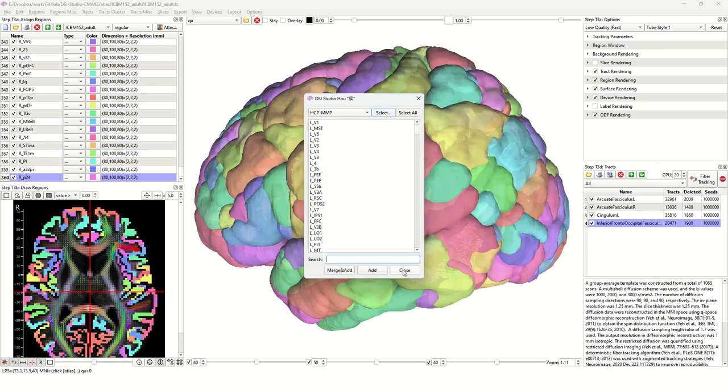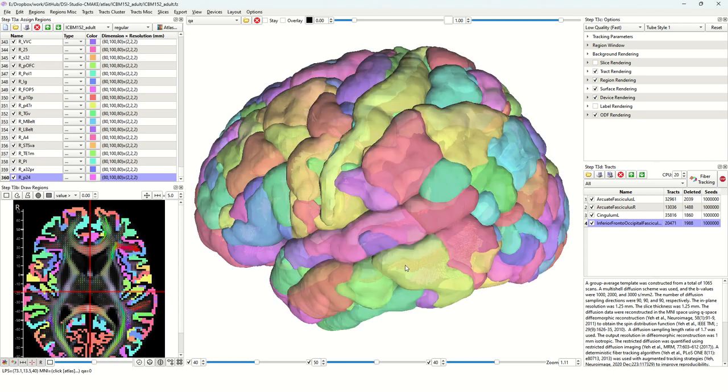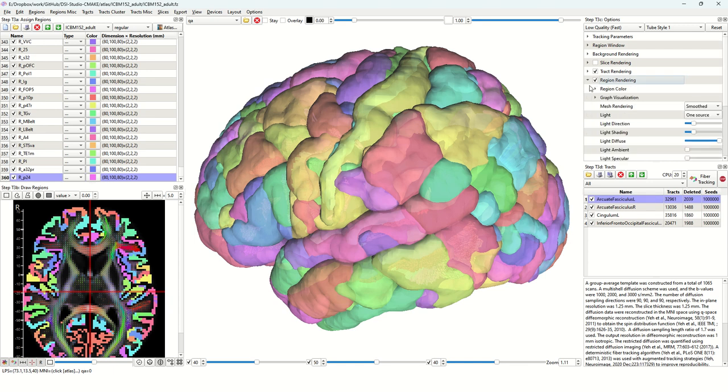Now we're ready to see how the tract-to-region connectome looks like. We select the first one, the arcuate fasciculus. Then let's go to the options under region rendering. Expand this, and there's a group called region color. If you're not seeing this, likely you're using an older version and you'll need to update DSS Studio.